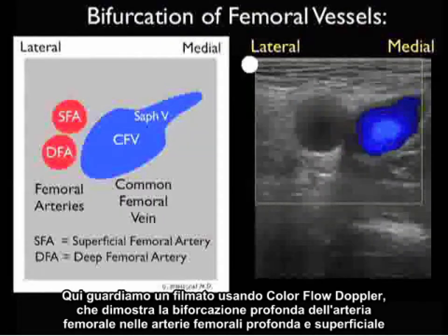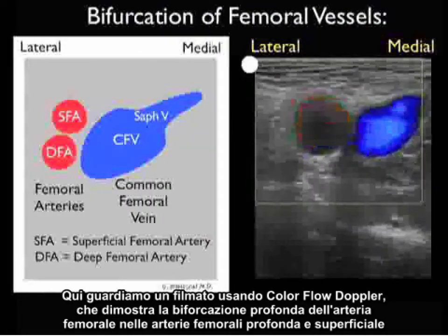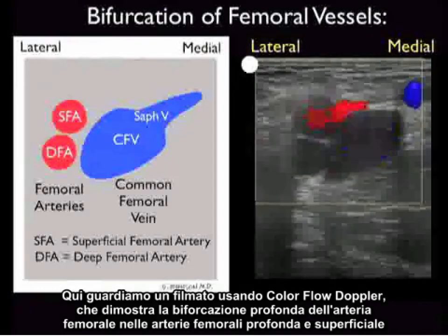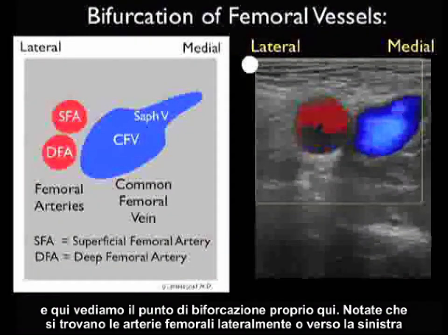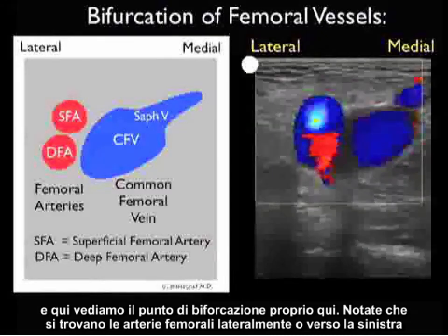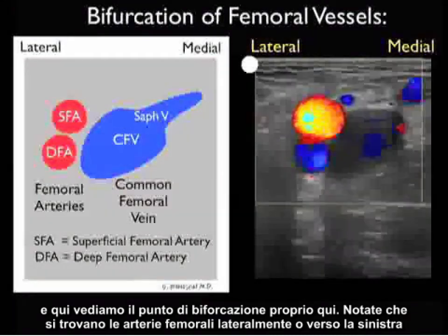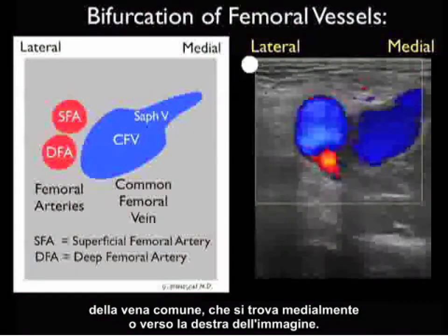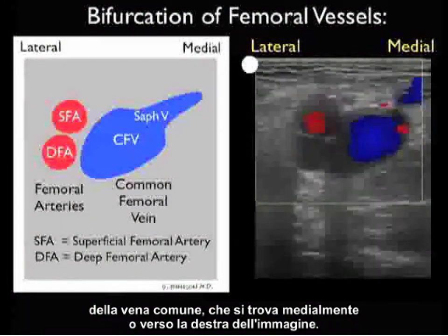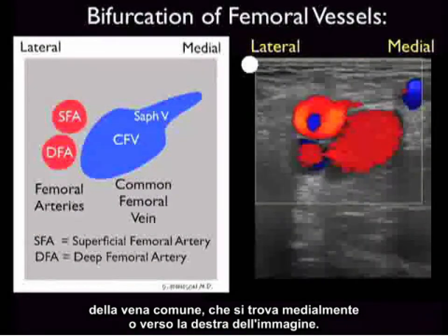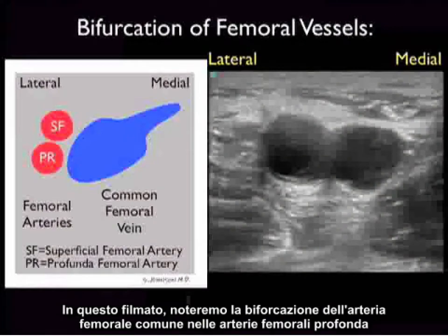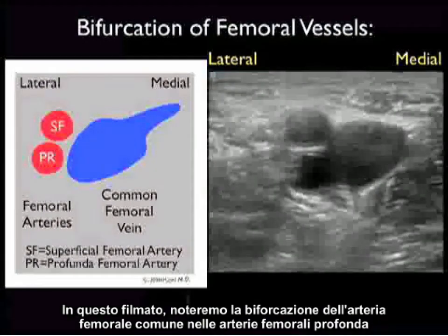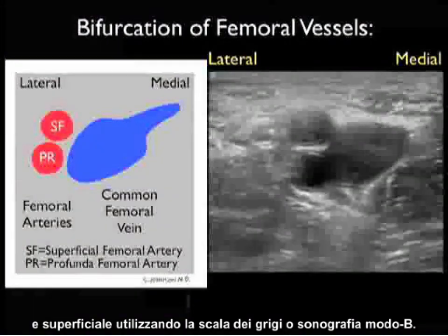Here we see a video clip using color flow Doppler demonstrating the bifurcation of the femoral artery into the superficial and deep femoral arteries, with that bifurcation point visible here. Notice that the femoral arteries are located laterally or towards the left of the common femoral vein, which we see located medially or towards the right of the image.